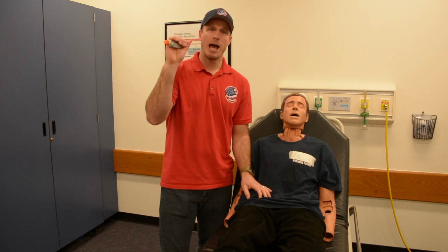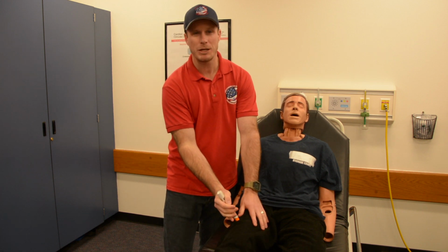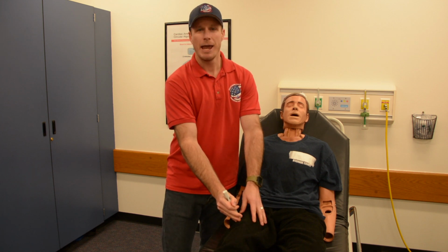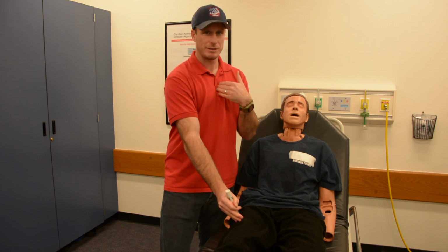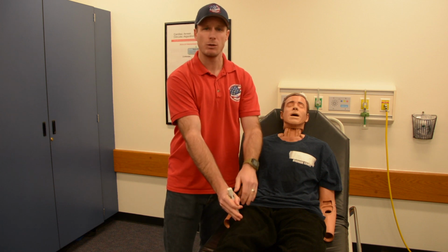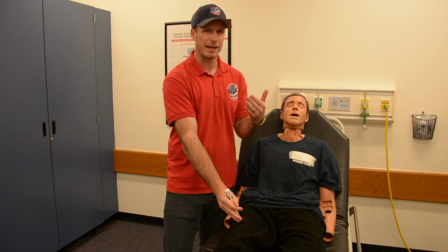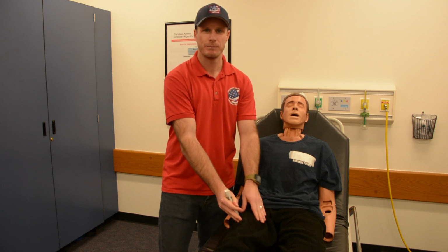Once we have our epinephrine in hand, we're going to push it into the patient's outer thigh, and we should hear a click. So I'm going to push this into my patient's outer thigh, and once I hear that click, I know it's been administered. Now, we follow the 10, 10, and 10 rule when we're administering epinephrine, which means we go 10 inches above the knee or 10 inches below the hip. Then we're going to hold it inside the patient's leg for 10 seconds to make sure we administer all of that medication into my patient's muscle.